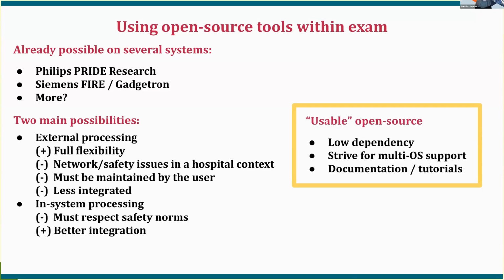And we tried to make those tools as usable as possible because we knew from the beginning that we had to implement them in other centers. So we made them as low dependency as possible. We used only libraries that support multi-OS, and we tried to write good documentation from the beginning.